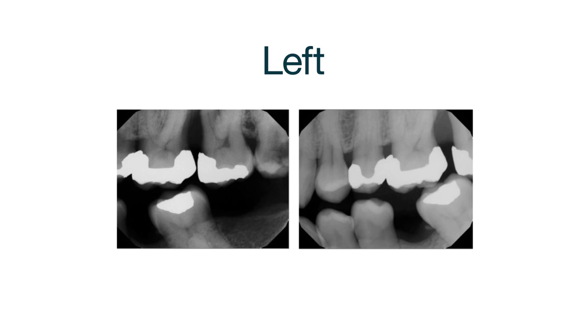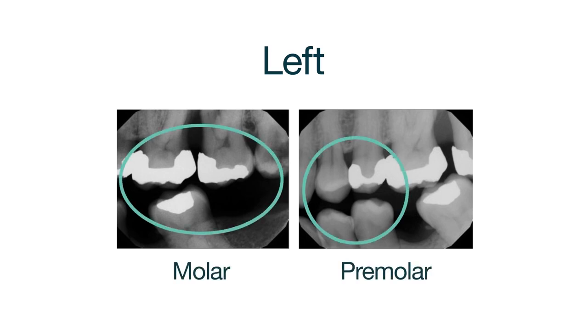To complete the bite wing series, perform the same steps for the left molar and premolar teeth.